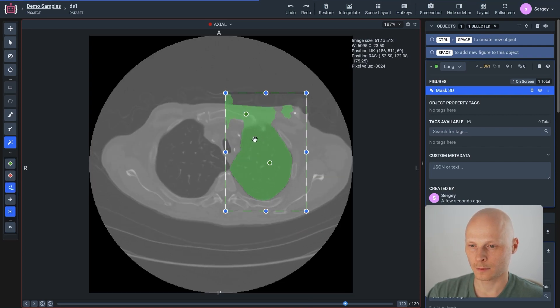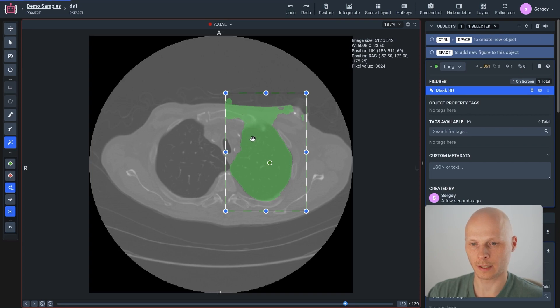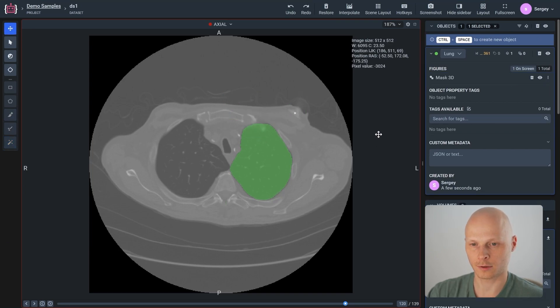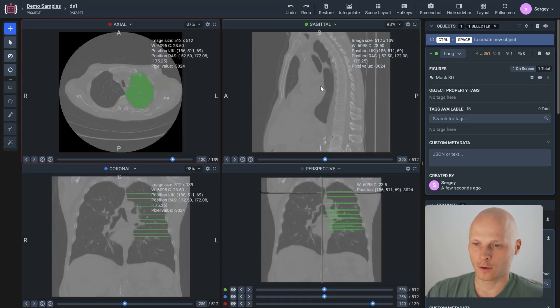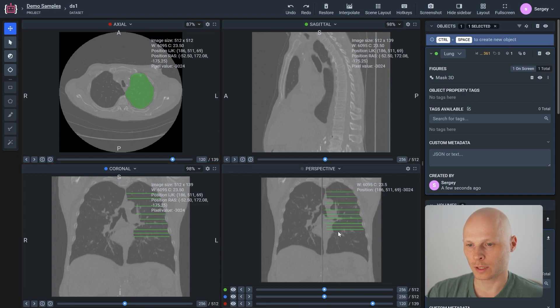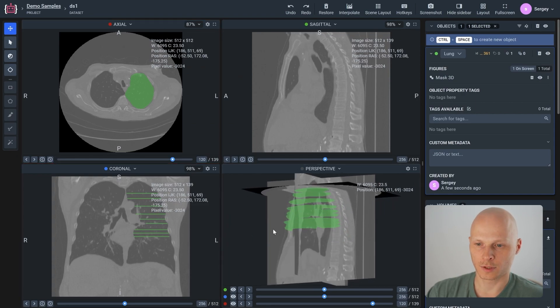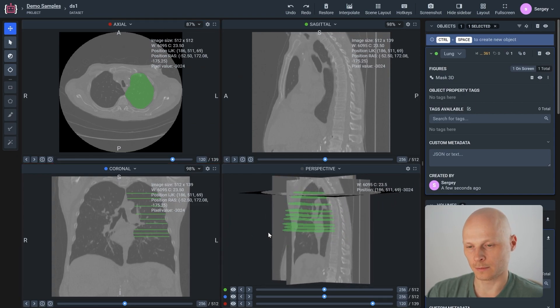We have finished labeling our object on different projections and planes such as axial, coronal and sagittal. Of course, we can see all of them in 3D.